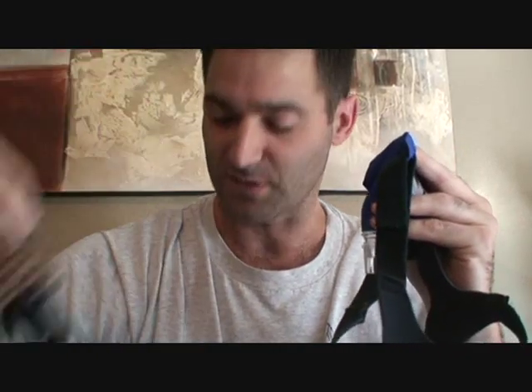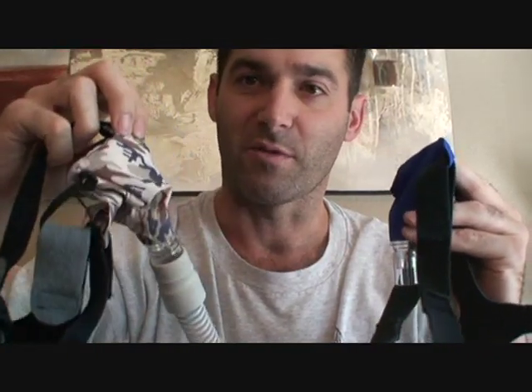I would say this material out here, this is the blue one. There's some other ones that have kind of cool designs, like leopard skin. This one is camouflage, which is the one I've been using mostly at night. This is the one I've been washing to see how long it holds up. Holds up very well. Let me get to the mask itself. This is made of a material that you would see on like a windbreaker or like a waterproof jacket. So the air is not going to escape it at all.